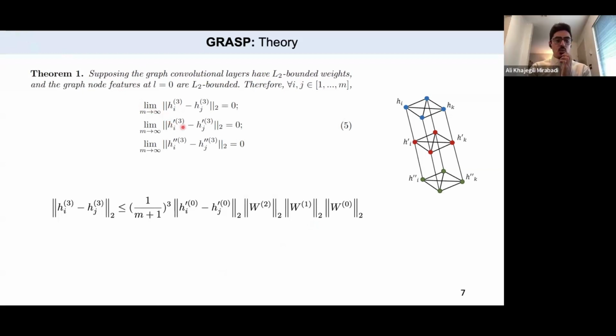Yes, because we wanted to make a fair comparison, we fed the same set of patches to the ABMIL. But the standard for ABMIL is 20x, what they did in their paper. So we reported only 20x in the paper. We have done experiments on 5x and 10x with the same patches for the model.